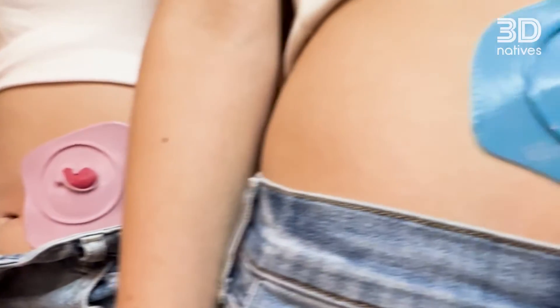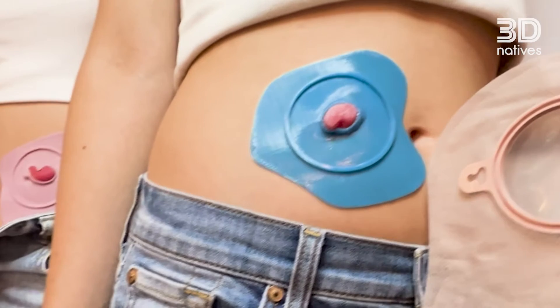ODAPT is the first 3D-printed wafer that is fully designed to eliminate leaks and is fully customized to the patient's anatomy.